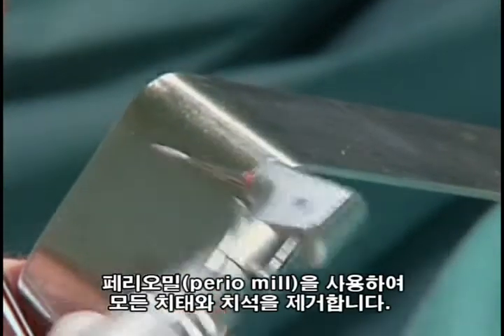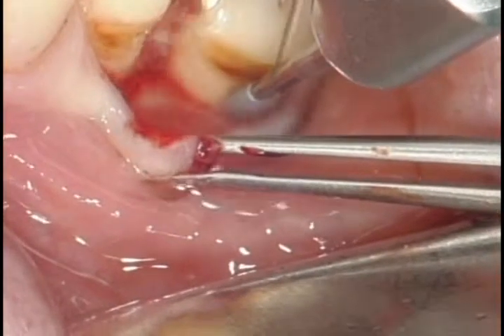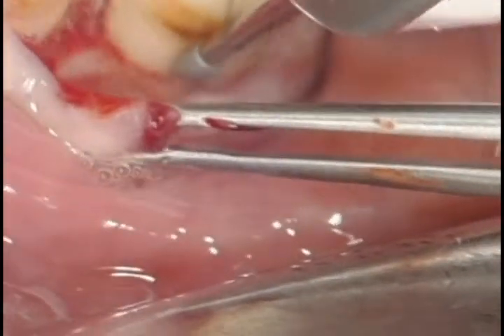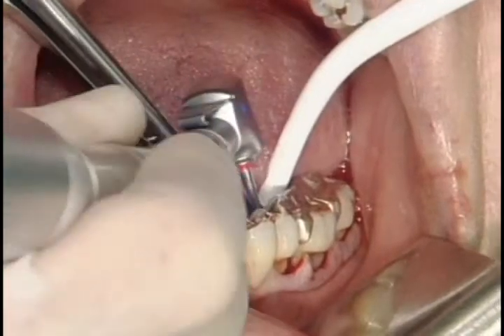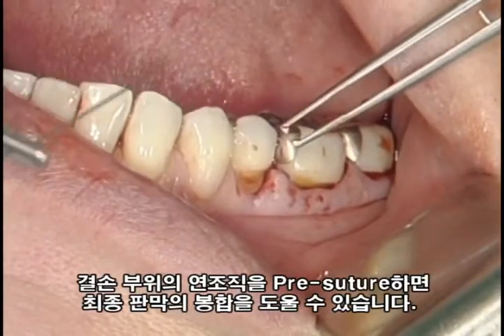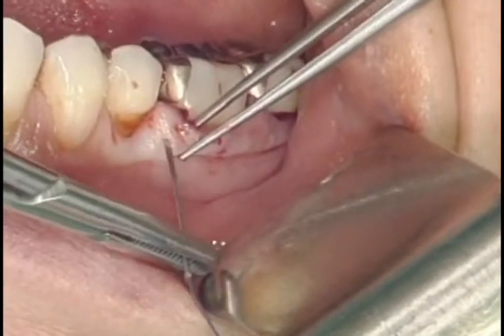A Perio mill is used to remove all plaque and calculus. Any impurity would endanger the successful treatment with Emdogain. Pre-suturing the soft tissue around the defect will help in closing the final flap.